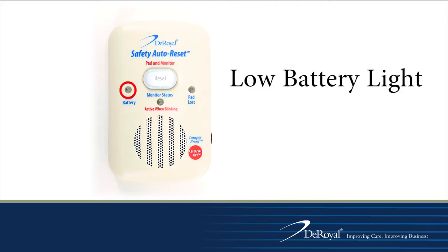Located to the left of the reset button is the low battery indicator. It will blink and the monitor will beep if the battery needs to be replaced. If connected to a nurse call system, the call system will be alerted as well.